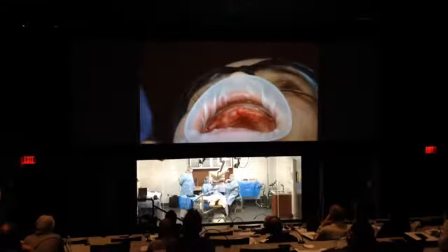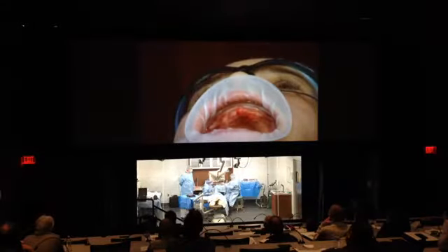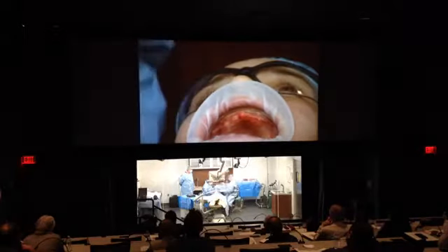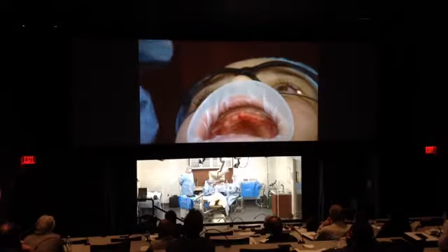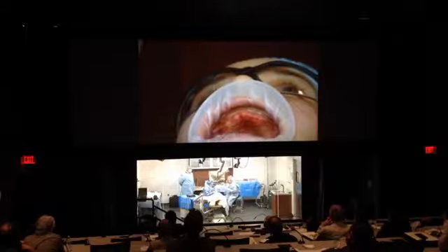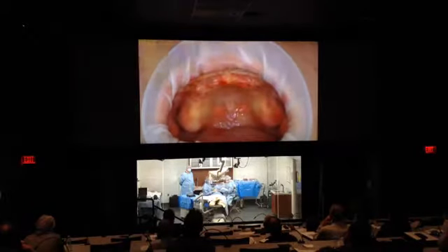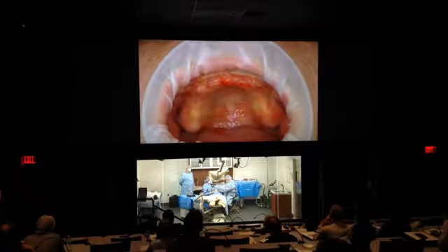Okay, so let's get started. If you feel anything, just raise your left hand. I can hear it, okay? Okay. All right, so we're going to start reflecting the flap here and making an incision. Let's have some light.